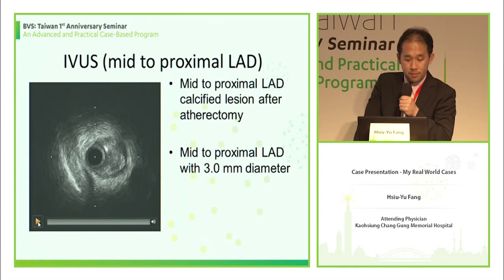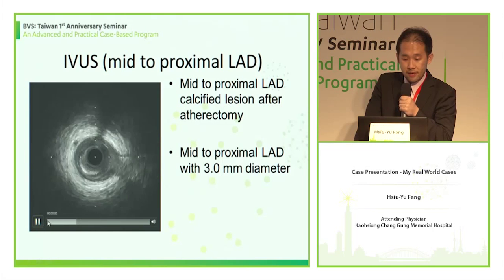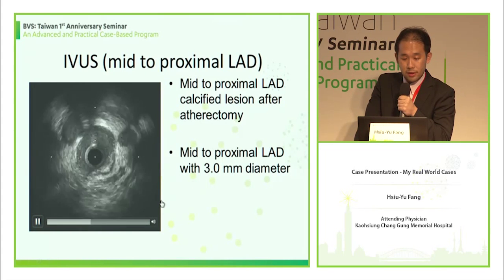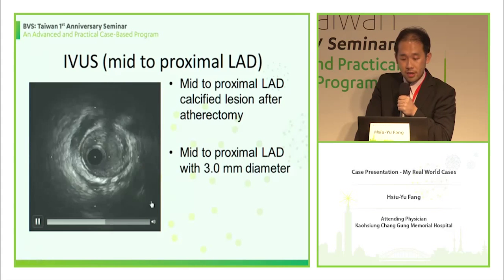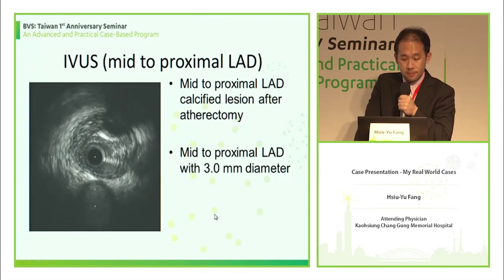And this is the IVUS from mid-LAD to the proximal LAD. You can see the very calcified lesion after atherectomy, and from mid-LAD to proximal LAD the diameter is up to 3.0 or even bigger.